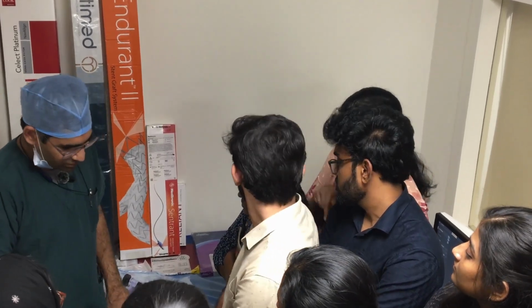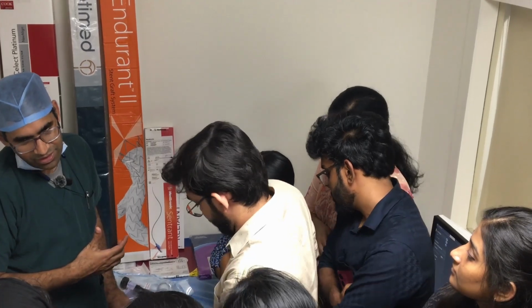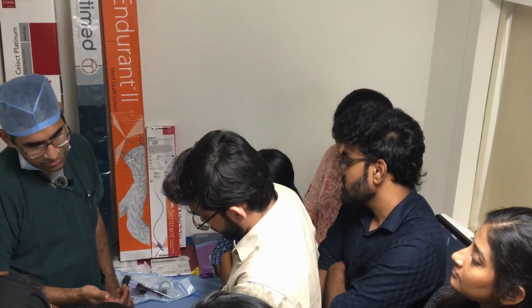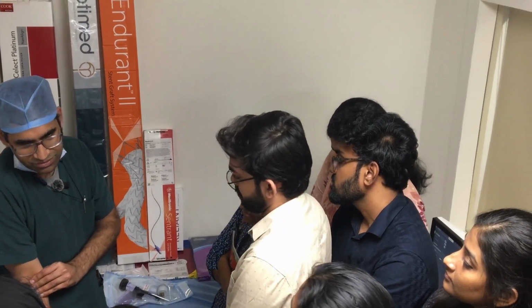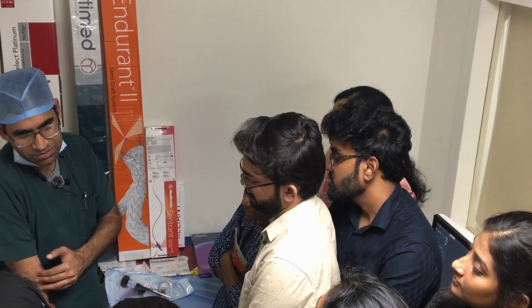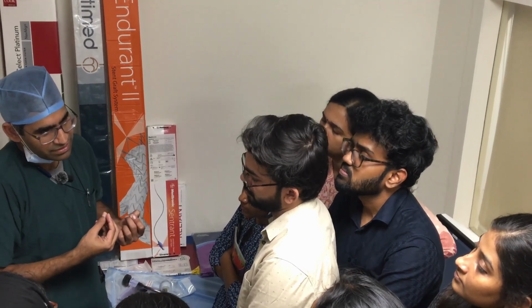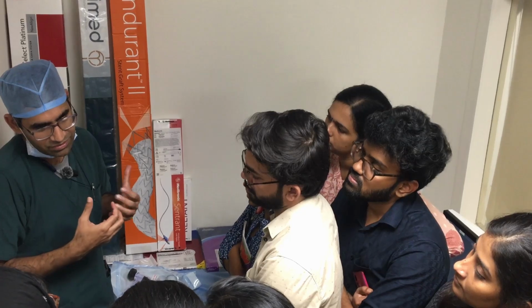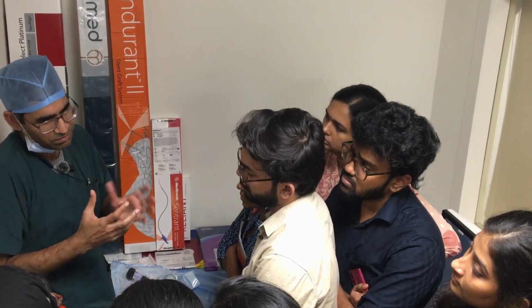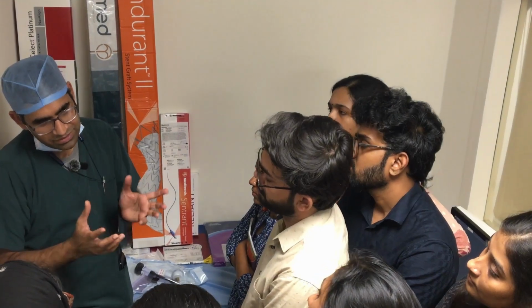So if you have to deploy a stent in your body, which is exposed outside. Suppose I have this thing, I can press it now. I can press it, somebody checks my pulse, and the stent will collapse. The balloon expandable stent should not be used in the exposed arteries. Any artery which is exposed, you should not. Simple. There are lots of nuances in that, but this is a simple thing to remember.